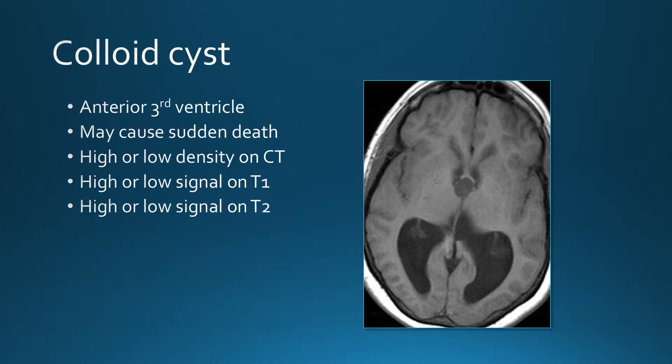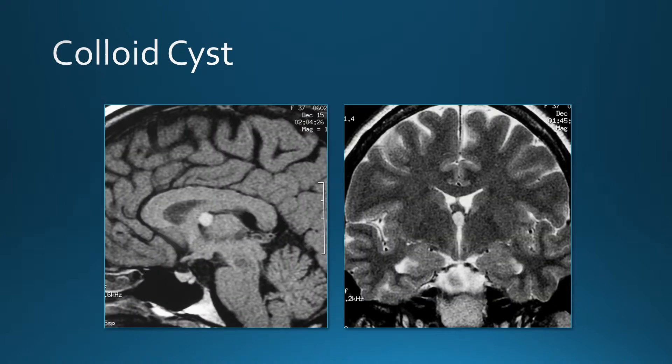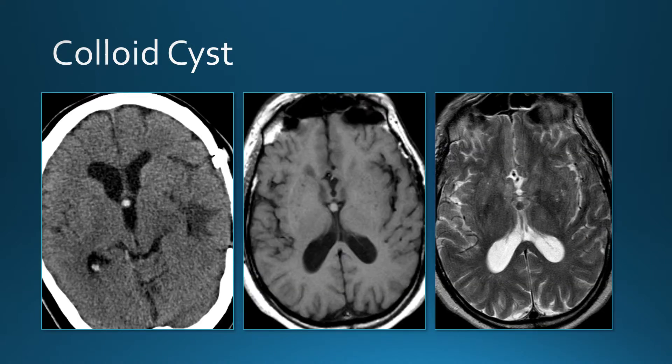Colloid cysts occur in the anterior third ventricle and can cause sudden death. On CT they can be high or low density. On MRI they can be bright or dark on T1, or bright or dark on T2 — the signal is very variable depending on the protein content. Here's a colloid cyst that's bright on T1 and bright on T2. Another one that's high density on CT, bright on T1, and dark on T2.